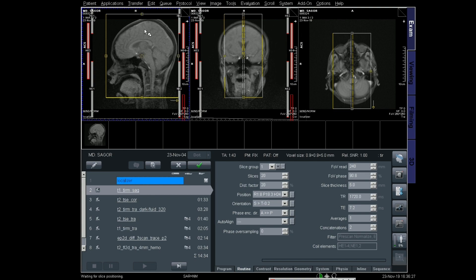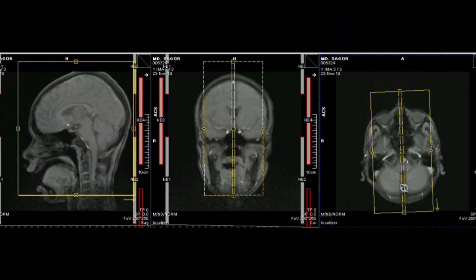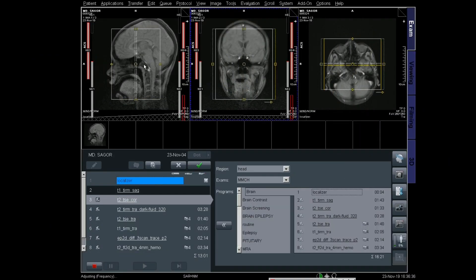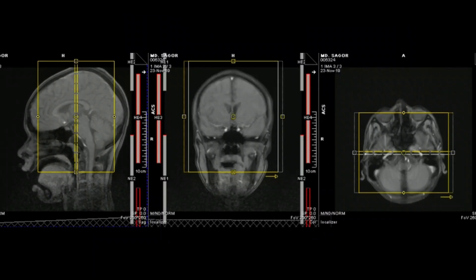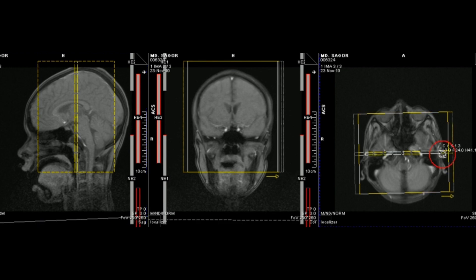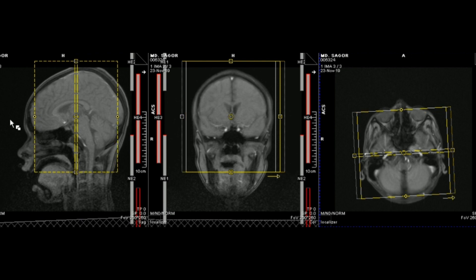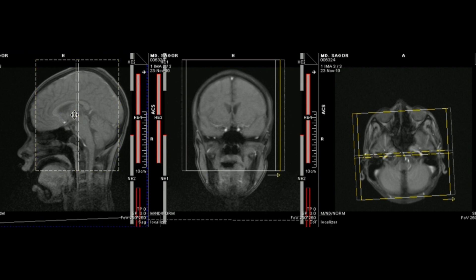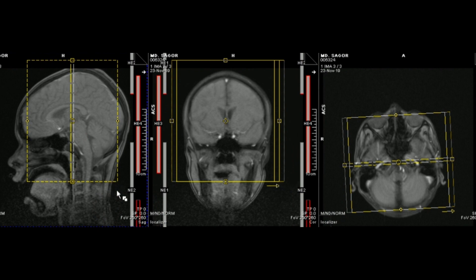On the axial image, the plan should be parallel to the midline of the brain. On the coronal image, it should be parallel along the third ventricle and brainstem. For the coronal image, plan on the axial and sagittal images — angle the plan perpendicular to the corpus callosum. If the head is tilted, plan perpendicular to the midline of the brain.